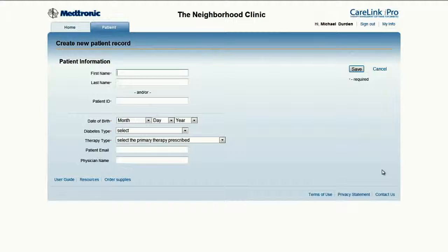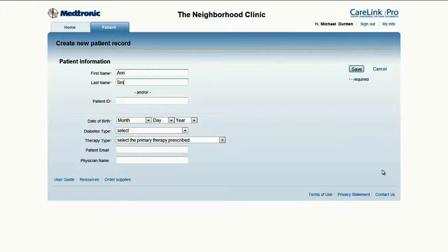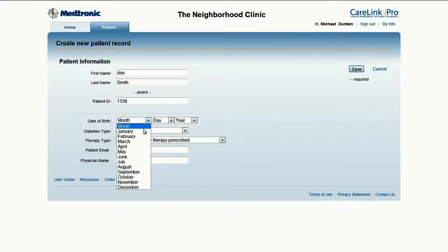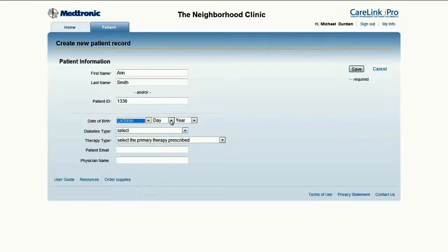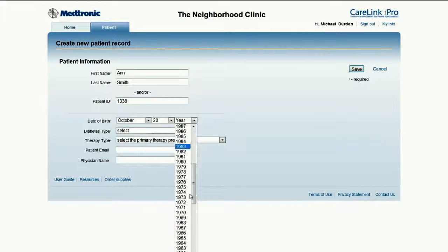The patient record page requires a couple of quick inputs to successfully set up a patient. For privacy concerns, either the patient's first and last name or the patient ID can be entered. Both name and patient ID can be used as well, as demonstrated here with hypothetical patient Ann Smith, who has patient number 1338. Next, enter the patient's date of birth — in this case, Ann was born on October 20, 1950.